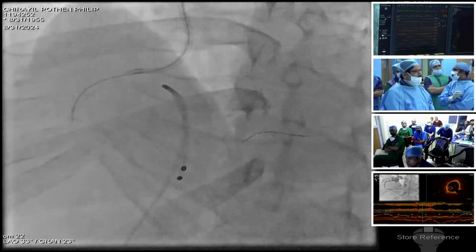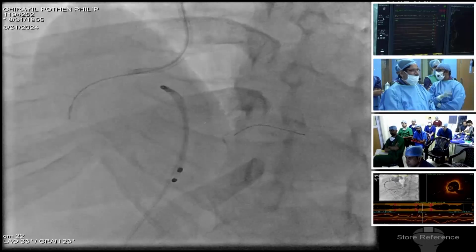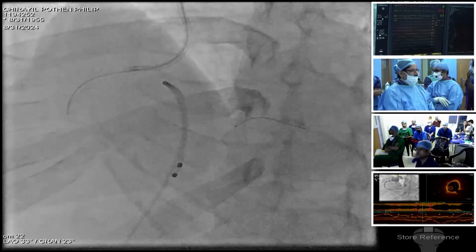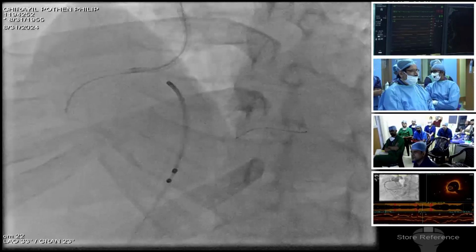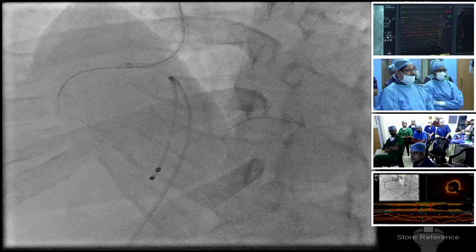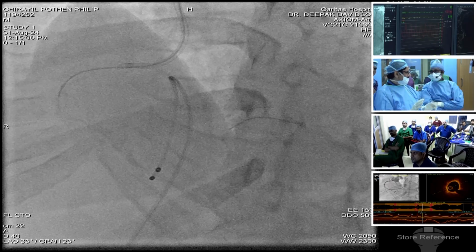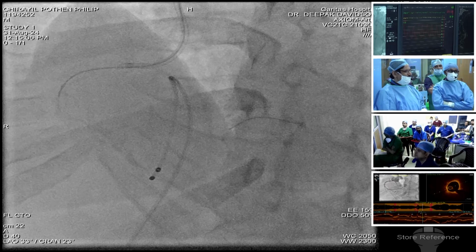Here we are much more happier because the lumen is reasonable. The flow, we are sure that the flow is going to be there even when you park the crown over there inside the lesion. When it becomes much more tighter, in those situations probably you'll have to pull it back to reduce the amount of ischemia during the procedure. But the change of the sound is less actually. Yeah, unlike previous. True. Very, very tight lesion and damping sound we were able to appreciate.